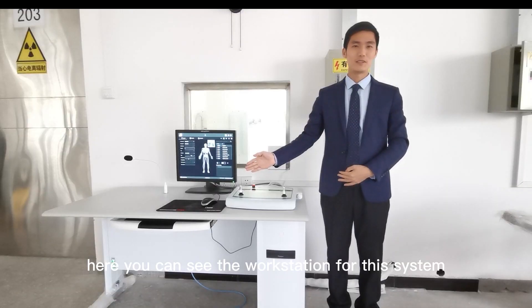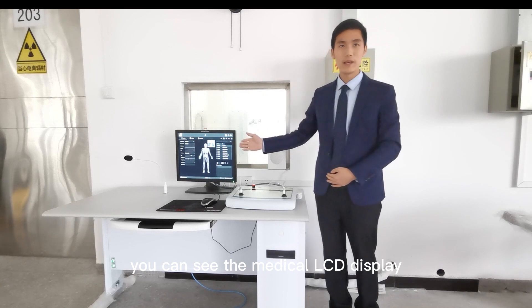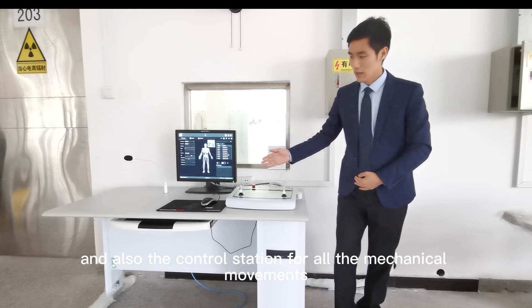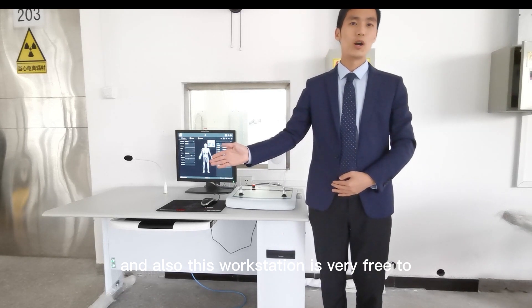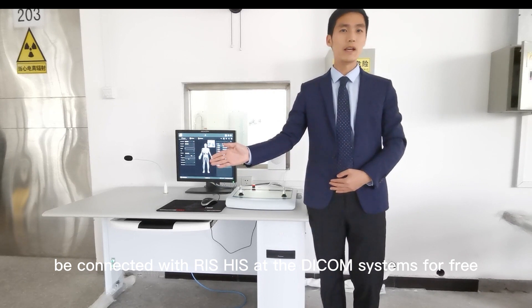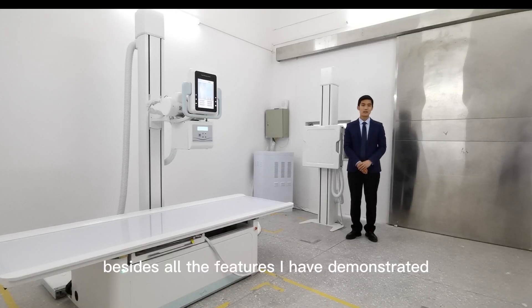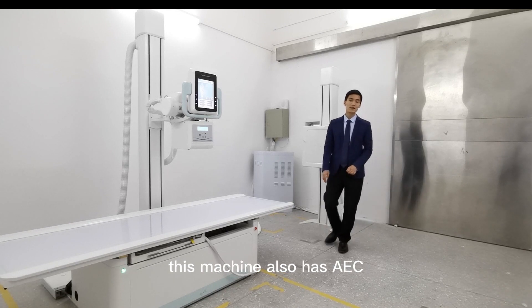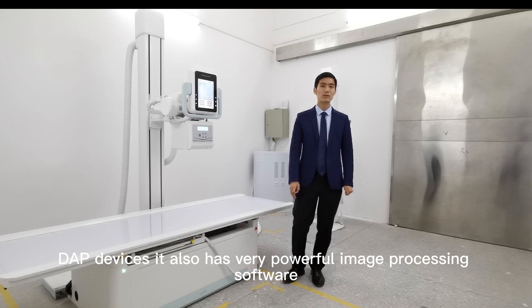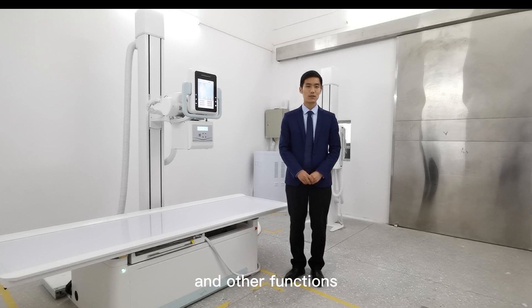Here you can see the workstation for this system — the medical LCD display and the control station for all the mechanical movements. This workstation can be freely connected with PACS and DICOM systems for easy information transmission. This machine also has AEC and DAP devices, and very powerful image processing software able to make automatic image stitching and other functions.